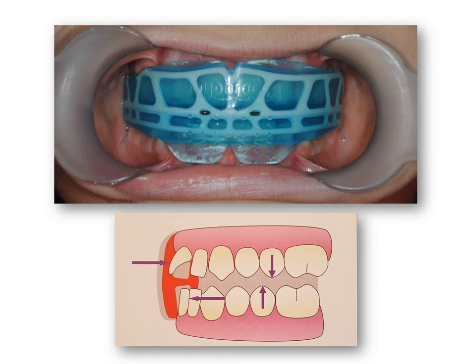And at this moment, we switched to a prefabricated myofunctional appliance, a trainer, that gives us some effects at the same time: retrusion of the upper incisors, protrusion at the beginning of the lower incisors, extrusion of the molars and the premolars, and also a very important thing, intrusion of the incisors. Especially when the patient wears these appliances during daytime, at least 2 hours per day, with the appropriate myofunctional exercises.